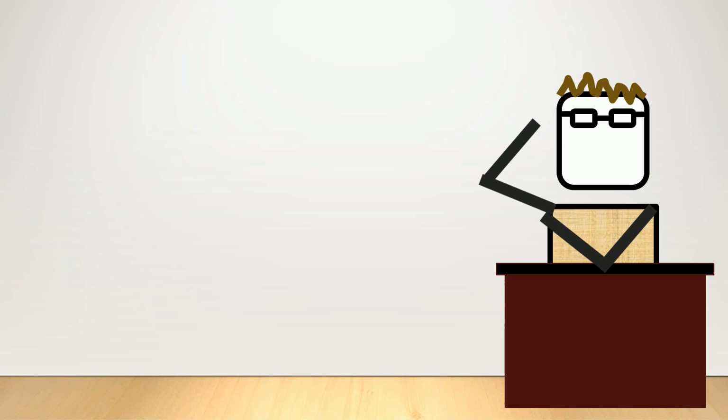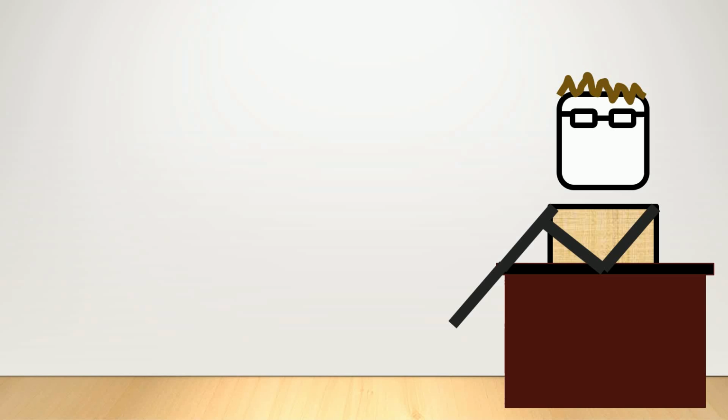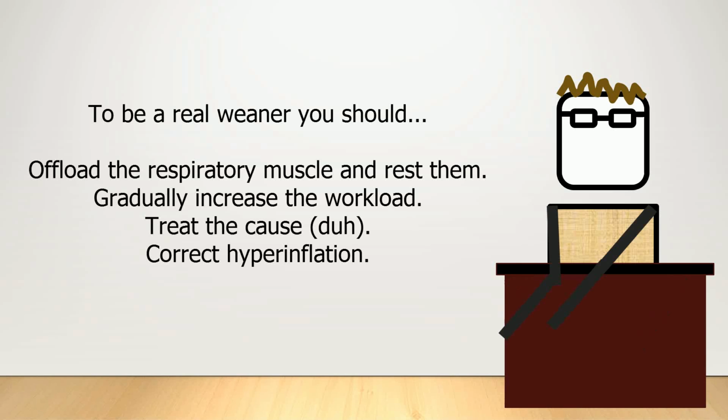When patients fail a weaning trial, it's usually because the work of breathing exceeds their ability to generate the necessary muscle power to do that work. Persistent hyperinflation also increases the load and is a major determinant in weaning success. Therefore, the success of weaning depends on reducing the load of the muscles with the ventilator and increasing muscle power by providing rest with graduating work over time.